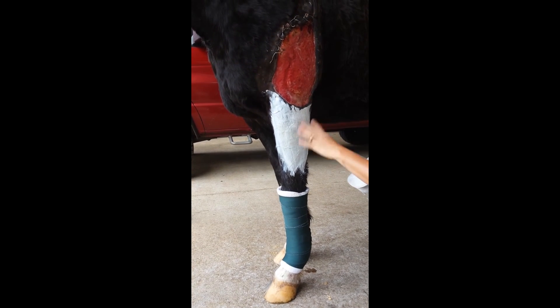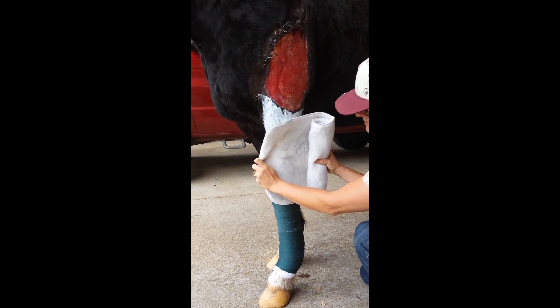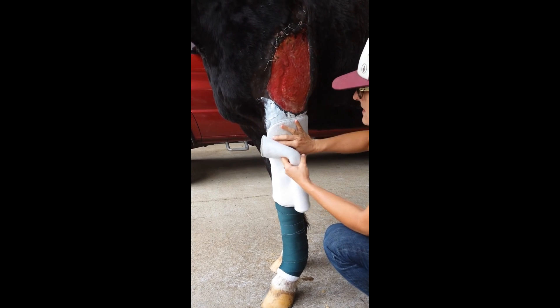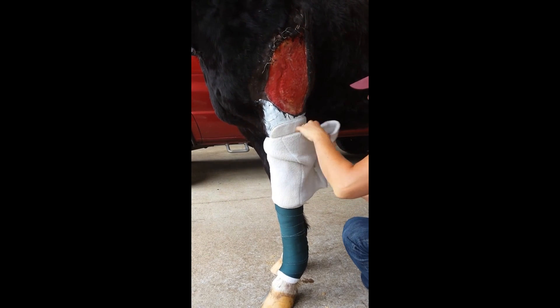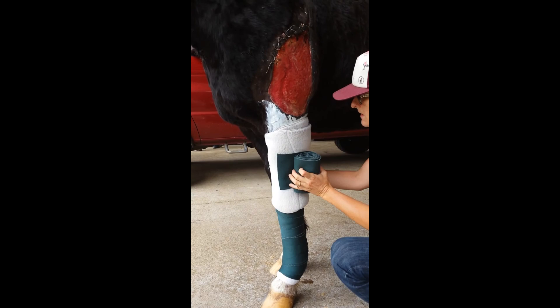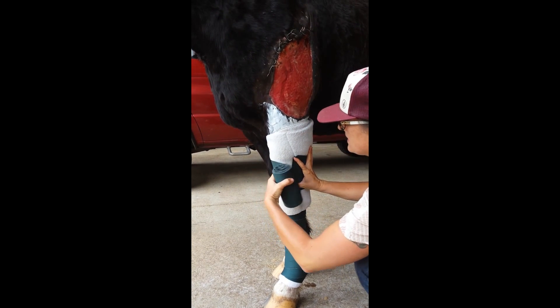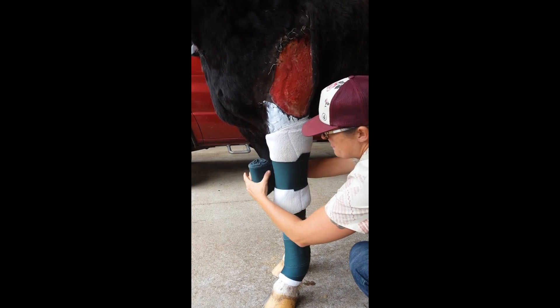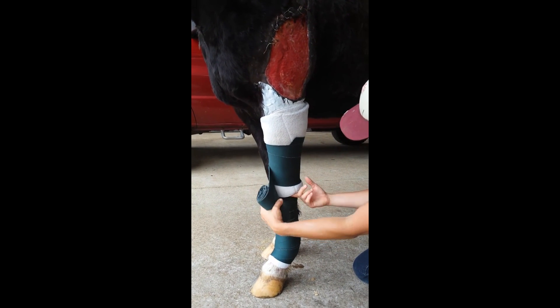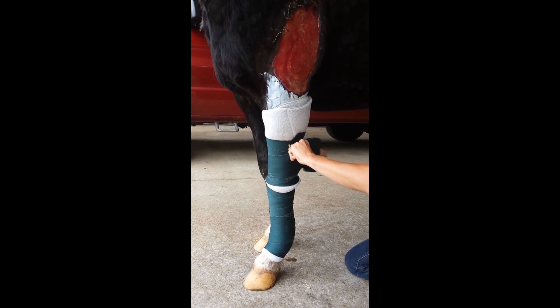Then I put this wrap on. This white stuff is a zinc oxide ointment just to keep her skin from scalding because of the discharge getting on her hair. So I just stack this on top of the other one — same concept. I want to make sure it's nice and smooth with no wrinkles anywhere. Then I use my nylon wrap over the top. Sometimes it helps to have an extra person kind of holding it when the leg gets this big in diameter and it's harder to get your hands around. Starting at the midpoint and traveling down the leg, I don't want to go all the way over the white because then my nylon would curl under, so I leave a little bit of the white sticking out. Then wrap back up the leg.